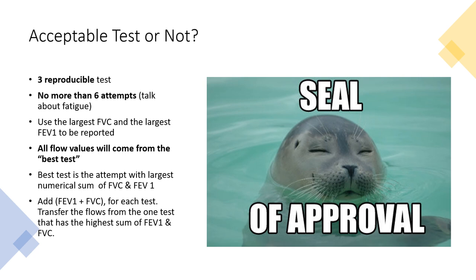So what makes a test acceptable? Well, there should be three reproducible tests. They should all be within 150 mLs or 5% of each other. There should be no more than 6 attempts, right? They can tire out pretty easily, and you guys will practice this, so you'll find out for yourselves. It can be pretty fatiguing.